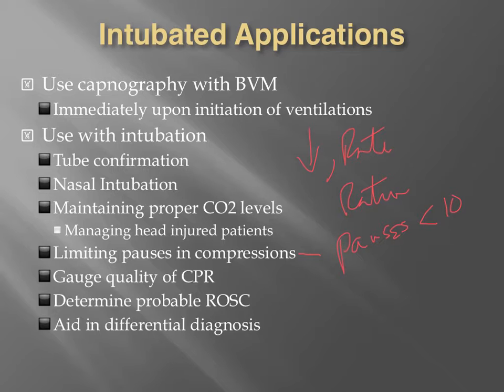Maybe we're doing really good compressions and we have an ability to measure that as well, partly in capnography. And we can continue on with our compressions a little bit longer in order to limit the amount of times we stop. Maybe we want to keep on going for another minute or so because we're getting ready to push another med in. If we're getting ready to push another med in, why should we stop right now to switch out compressions? Maybe we can continue on and then switch out with the presence of the medication being pushed at the same time.